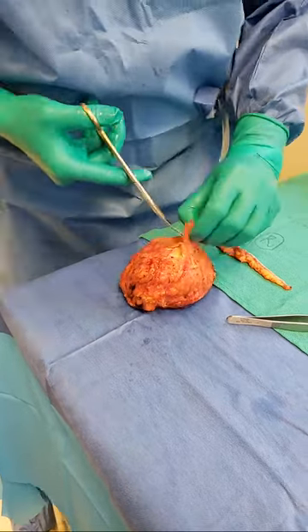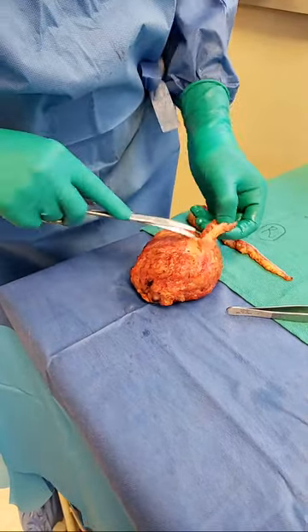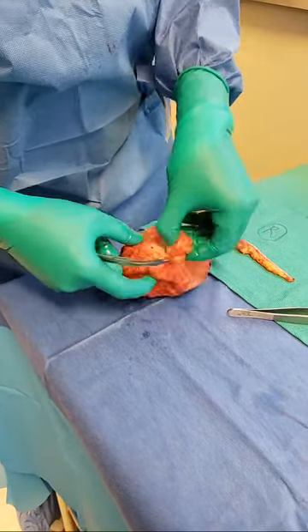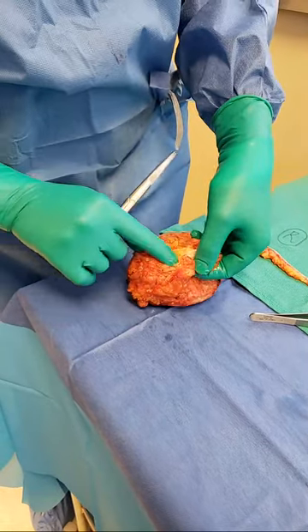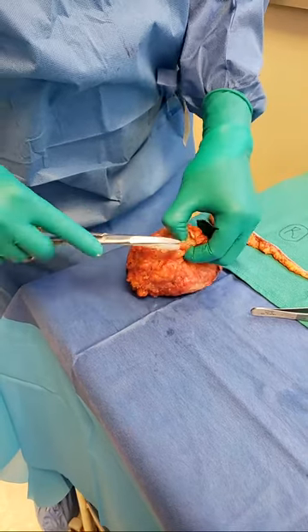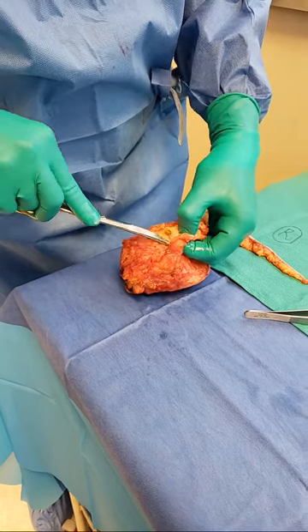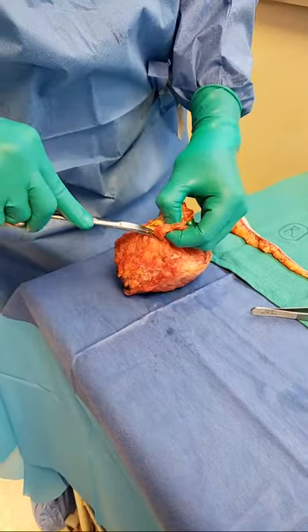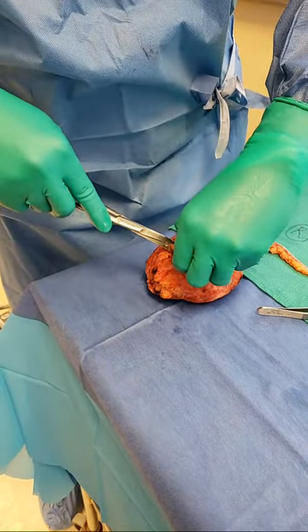I'm going to cut this open. All inflamed, angry tissue — this is scar tissue. You got the point why I need to remove all of this. Some of that can be fibrocystic disease, but again, this is abnormal tissue, and we'll have the pathologist weigh in on this. This is all scar tissue too — it's hard, it's not healthy tissue.